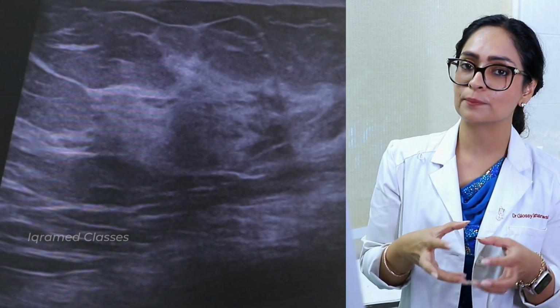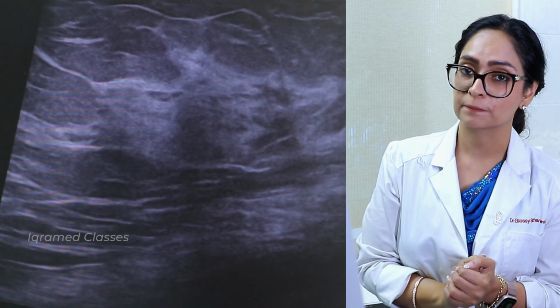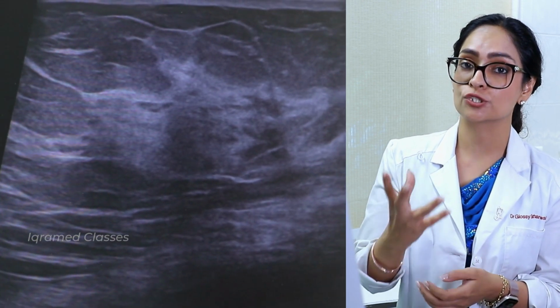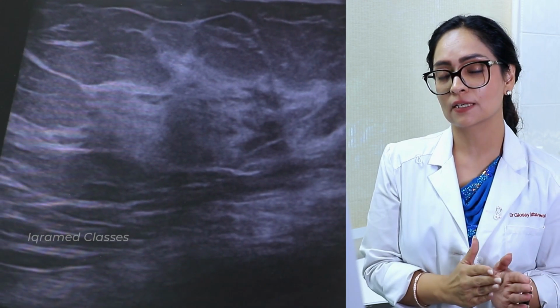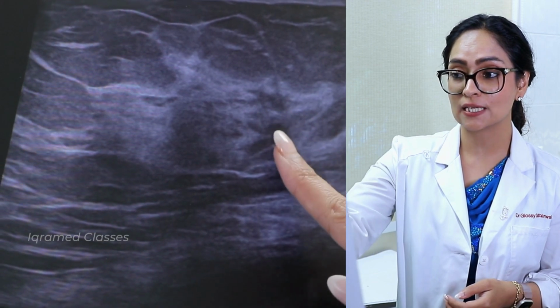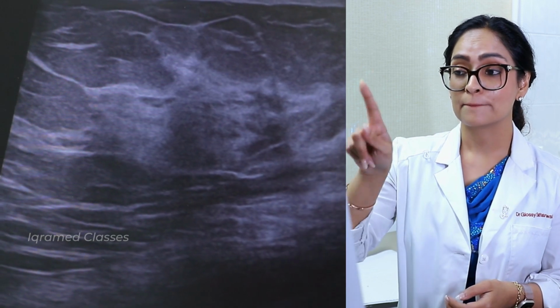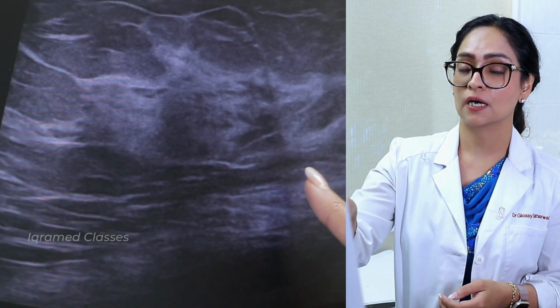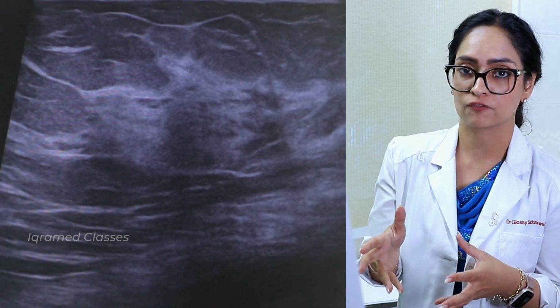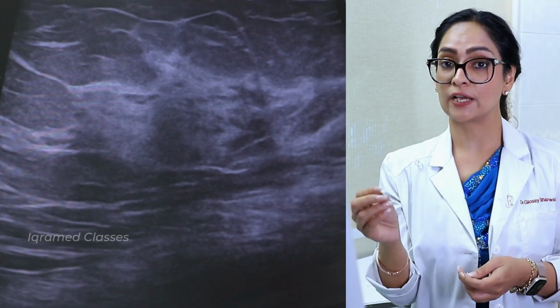What separates the breast fat appearance from the rest of the fat in the body? Whenever we talk about fat in the body and ultrasound, it is echogenic. But the breast parenchyma fat is hypoechoic. That is where the difference is. So what you see in between these hypoechoic areas, this is breast parenchyma fat. Breast fat is hypoechoic on ultrasound. That means it is dark. Not very, very black like fluid, but it is grey and dark. So it is darker than the fibrous tissue.